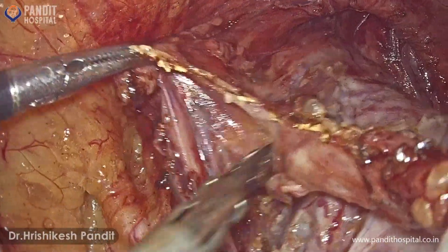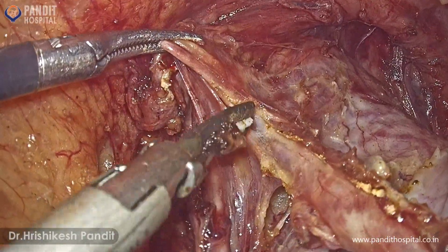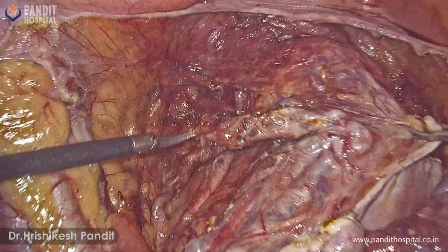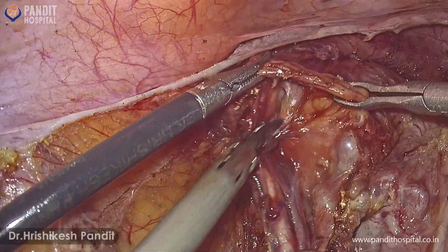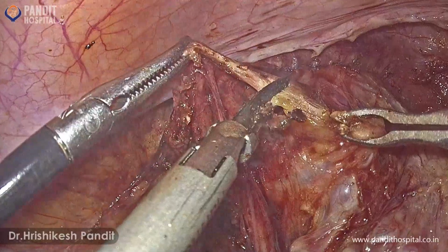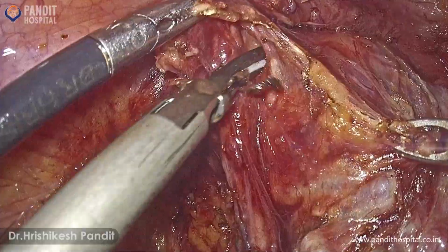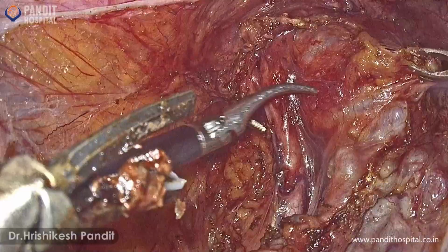We are dissecting on the lateral side of the bladder pillar to skeletonize the vesico-uterine ligament along with its containing vessels. The vesico-uterine ligament is then gradually coagulated and cut in small sections. Thereby, the left ureteric tunnel dissection is done.